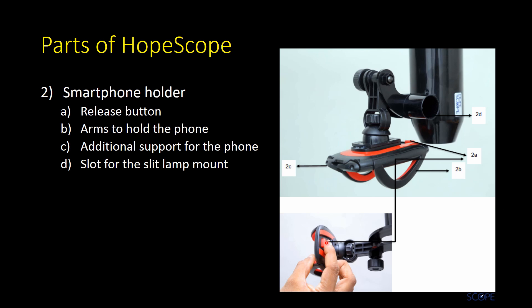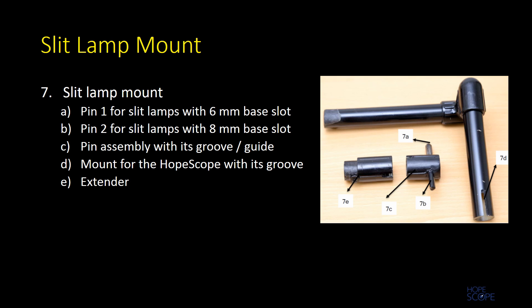The parts include the elbow joint for vertical alignment, the lens holder, and the optical tube expander. The smartphone holder has a release button which, when pressed firmly, releases the arm that holds the phone. There are additional supports for the phone, which are usually not required. There is a slot for the slit lamp mount.